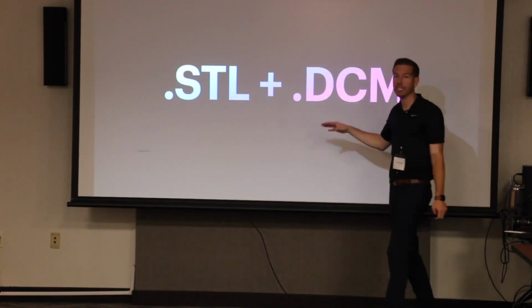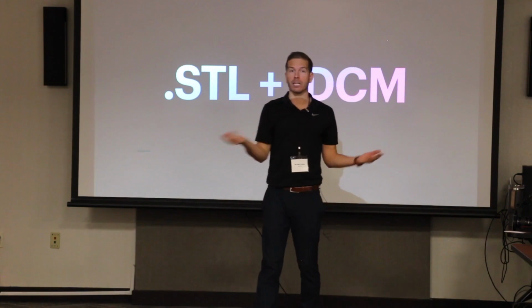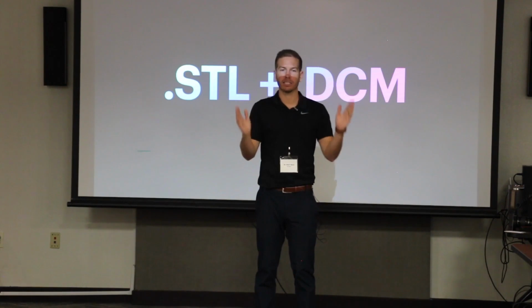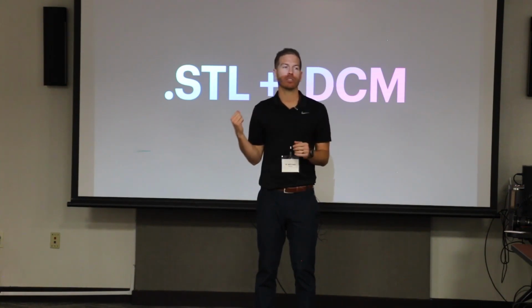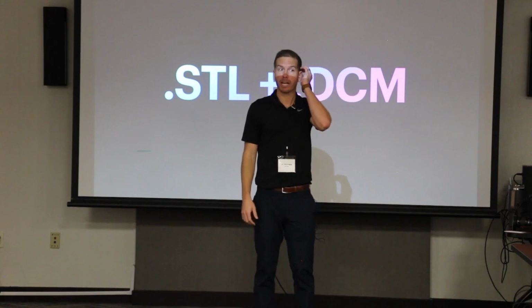Yes, you can use this kit with any implant, because an osteotomy is an osteotomy, right? Drilling a hole. When we think about doing our osteotomy, we've got to think about the principles of the osteotomy. Is our implant parallel? Is it tapered? You don't have to use these drills and match up this implant. I use this kit and we'll place other implants too. So you can mix and match.